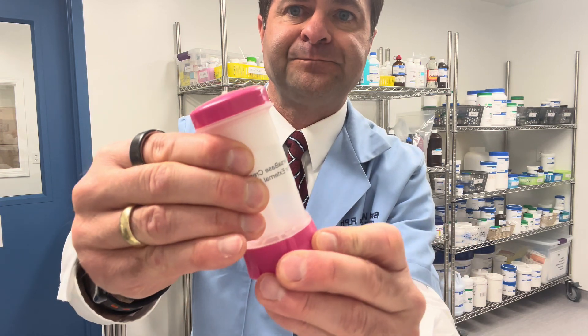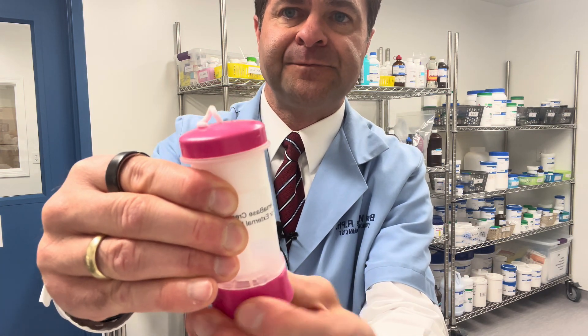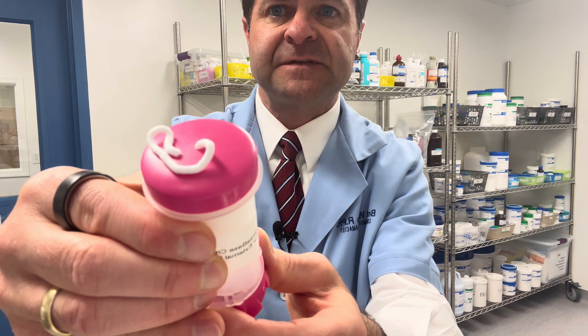I'm going to show you what two clicks looks like. We're going to rotate the bottom — that's one click, that's two clicks. You'll see the cream comes out the top.